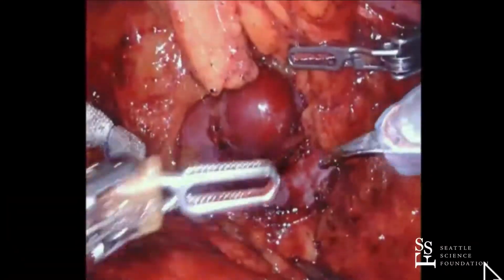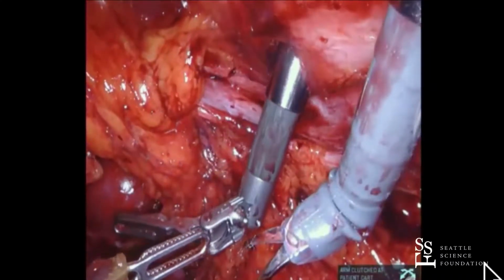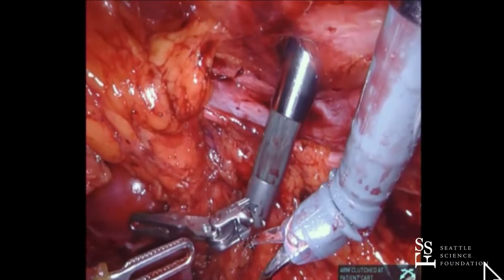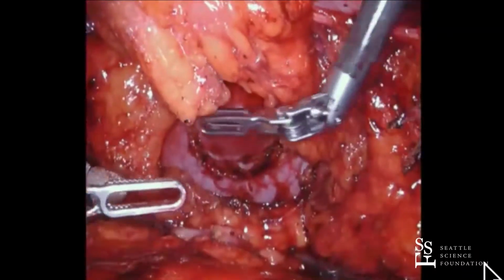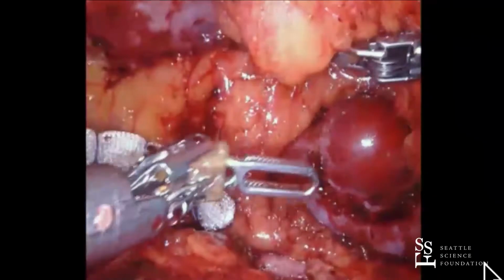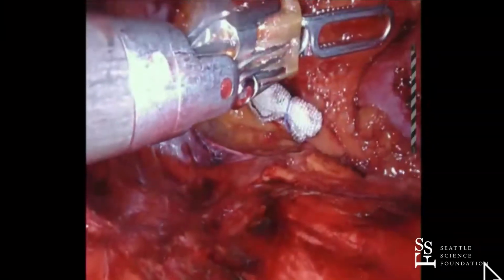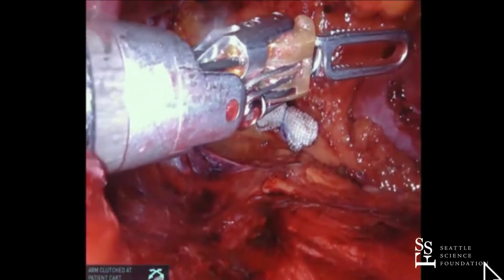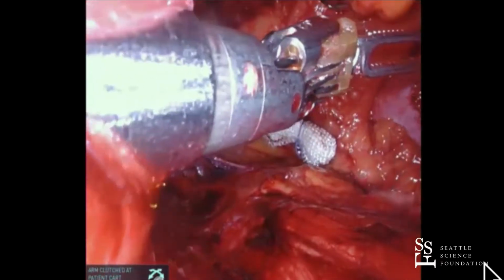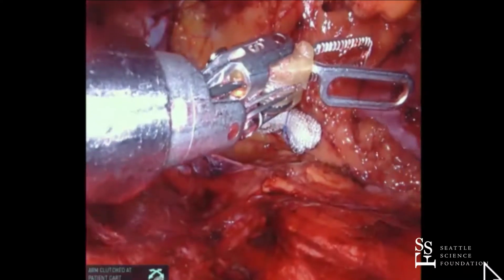Okay, let's go to the posterior. Whoa. Well, the forearm we're not going to exchange, but if you want to do that, yeah, let's do that. Might as well. Okay, back it up a little bit. Back it up, Brando. Yeah, okay. We're not going to exchange it, which is good news. And then this one posteriorly is the one that we've got to be aware of. Yeah, that one's out. So let's bring that in. Go ahead. In. Go ahead. There you go. And back, so you can see the critical nature of this kind of checklist.